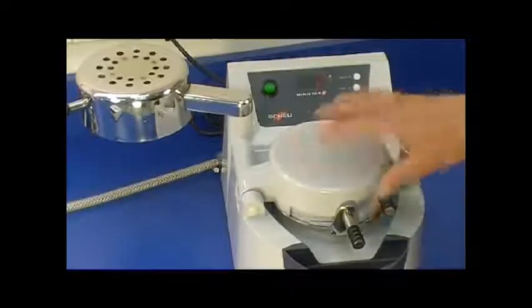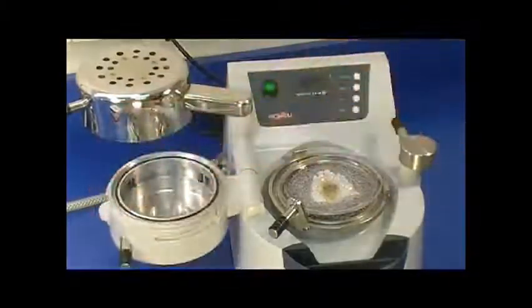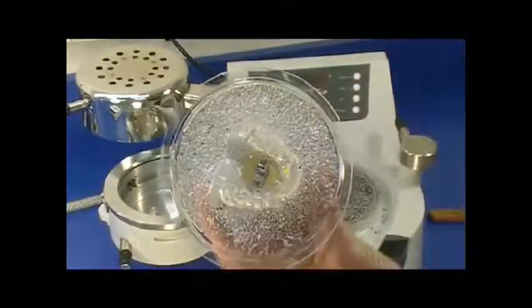Then unlock chamber and clamped material. Rotate chamber to left to open. Remove model and form material from pellets. Knock off excess pellets on plastic with knife handle.